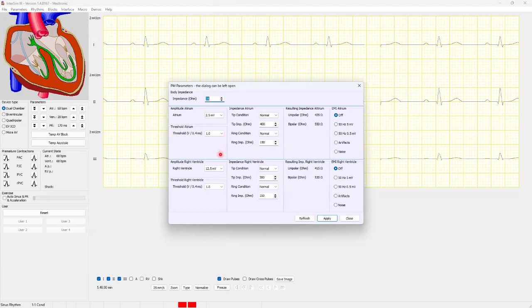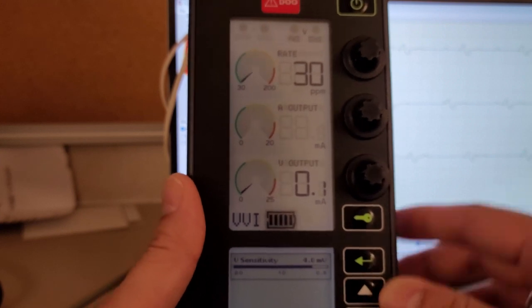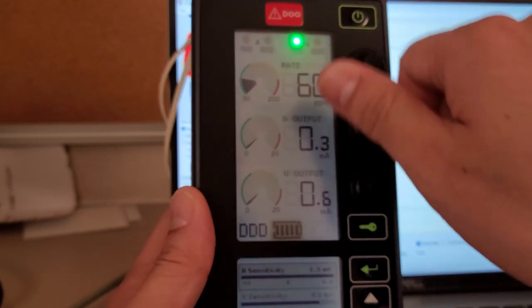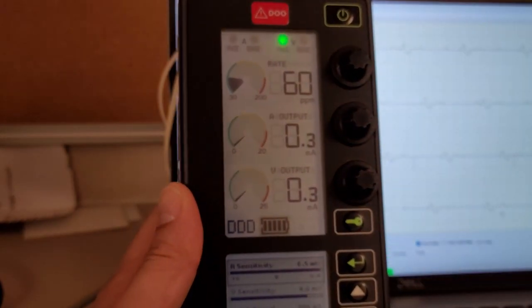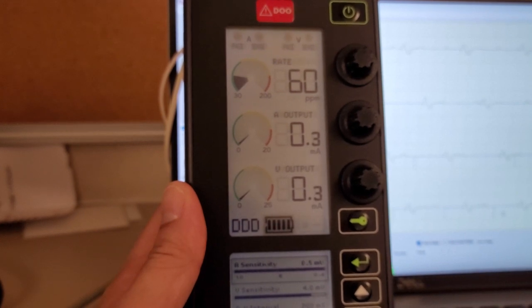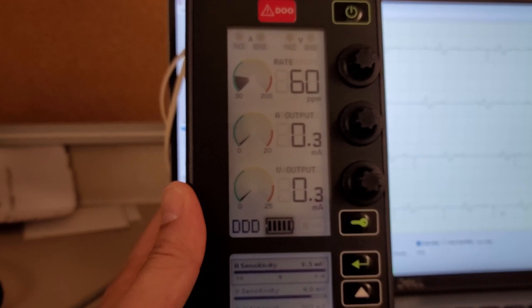With this, we can use a simulator to help teach them all these basic pacemaker concepts before they even touch a patient. One of the big advantages of the simulator is that one could play around with knobology, like turning on these buttons, turning this down, without actually practicing on real patients, which would allow safe learning as well as efficient learning. One could practice this over and over again to get it just right before they start trying these maneuvers on someone who's real and someone who could actually get hurt.